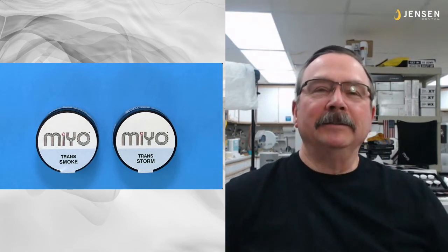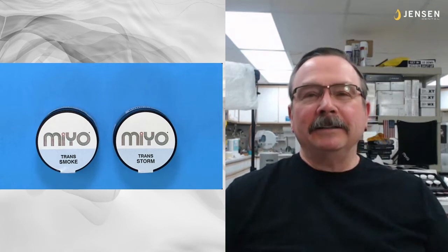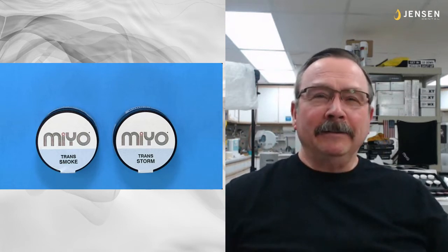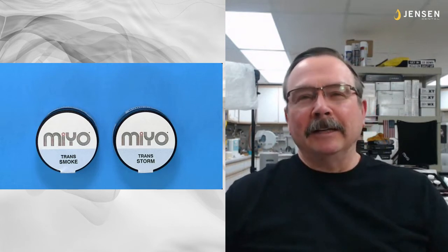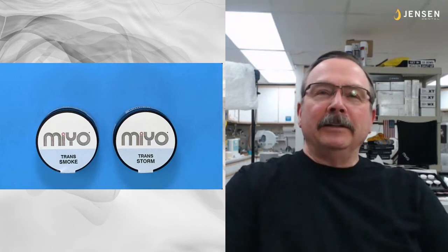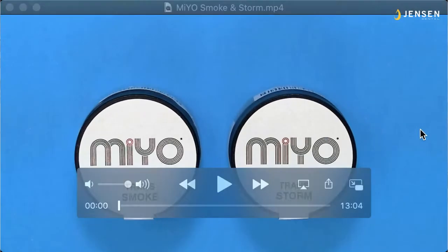This is Terry from Jensen Dental Technical Support, and today we're going to revisit a video I did a long time ago, and you might see a few changes in this because I've gotten a little bit better at it, and I just like everybody else's technique. Your technique is always evolving. If your technique's not evolving, you're not breathing. I seem to think that everybody gets either a little bit better or they learn something. But we're going to talk primarily about the translucent smoke and storm, which are ways to adjust value and increase translucency, or at least the illusion of it. So let's go ahead and get started with the old video, and we'll see what happens from there.